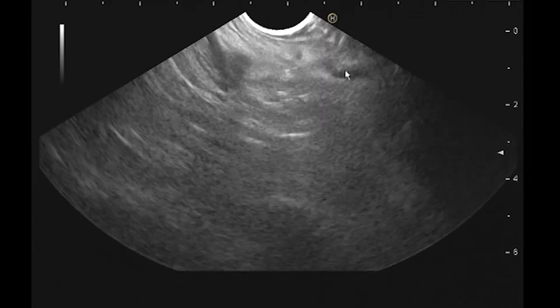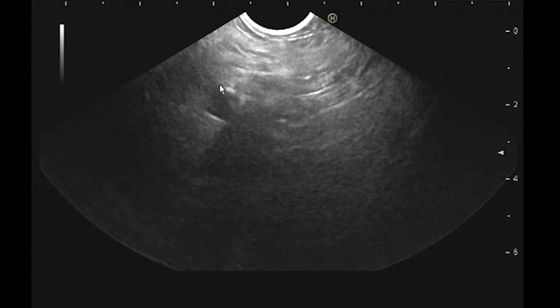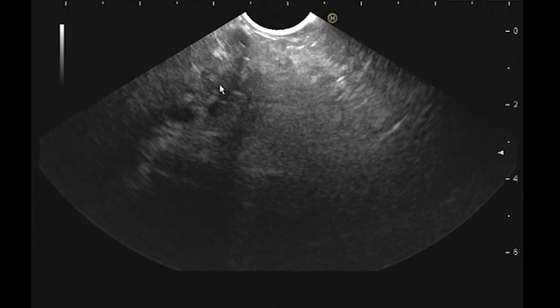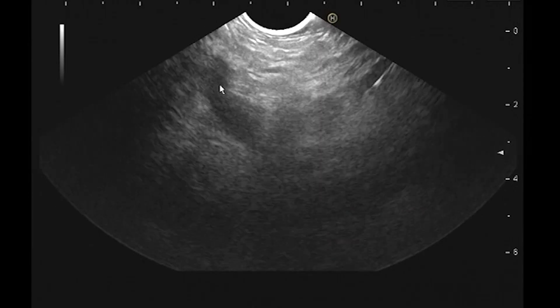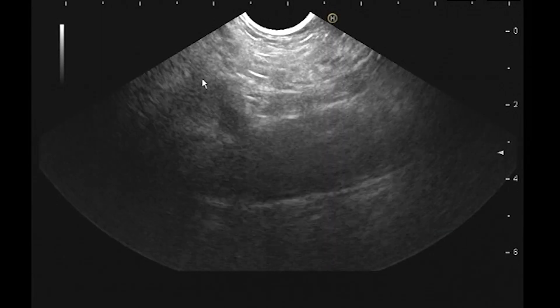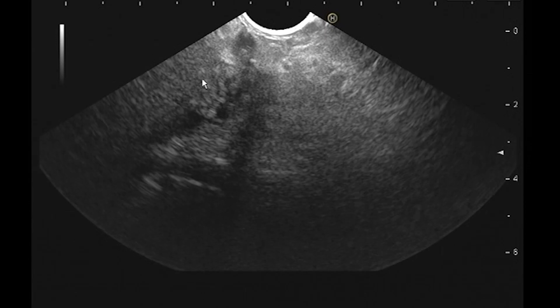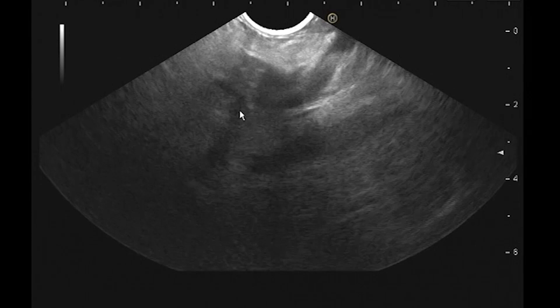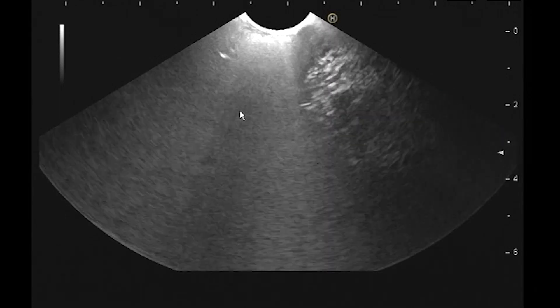I also forgot to look at the aorta. There's the aorta. I look at the celiac — there's the celiac coming out, because if she has arterial involvement, she's definitely not operable. The bifurcation of the celiac is bifurcating, but we're only seeing one of them, suggesting she's got encasement of the celiac very close to the bifurcation. So she's really inoperable — the confluence and the celiac. I'm going to take just another biopsy.